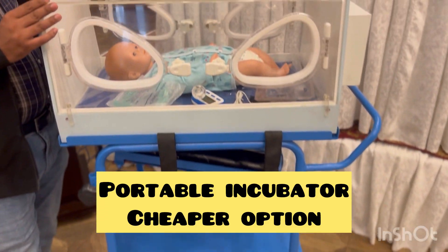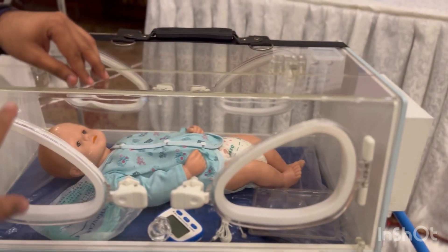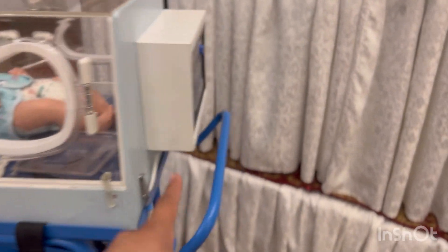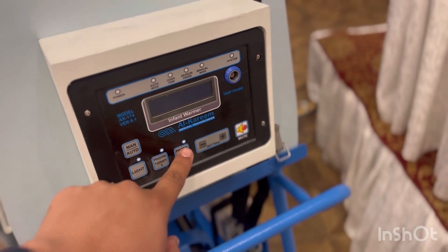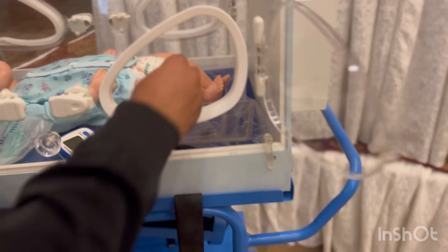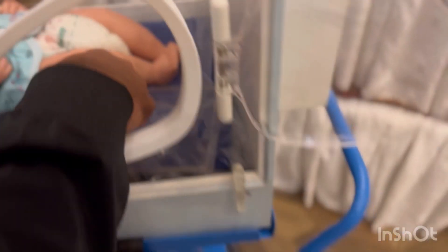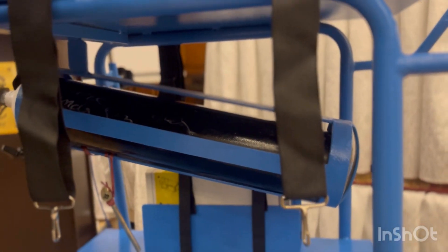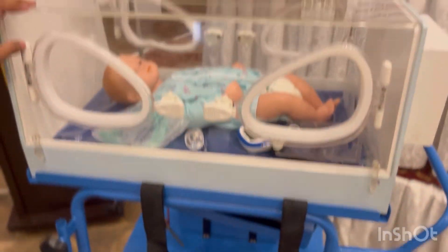Today we are going to show you a toned down version of the portable incubator which we shared in a previous video. This is a portable incubator which only has a battery-operated incubator to keep the baby warm, and the thermoregulator is inside as well. A baby can fit in it and you can transport it anywhere. There is an attached oxygen cylinder and some other necessary accessories.